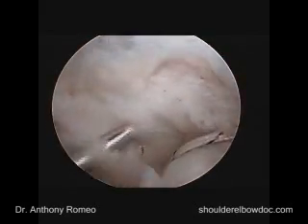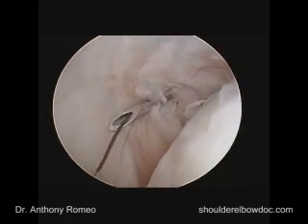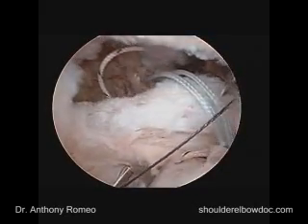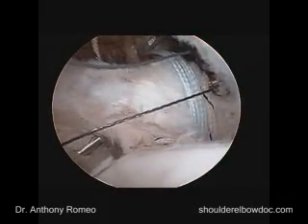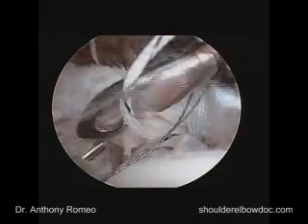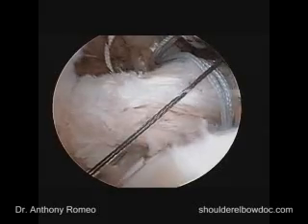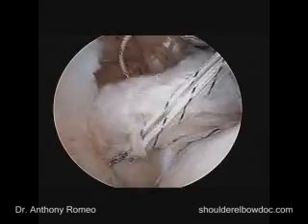Another technique we can demonstrate is we'll take a crochet hook, and we can do a single pass within the glenohumeral joint. The way we do that is a little bit more technically demanding, but we go through our suture wire, and then we can come back to our actual suture itself, and we pass around that suture. As we come around, we just turn our crochet hook and thread this through, and that'll give us another way to thread this suture through the wire loop. And then we can pop this on through.